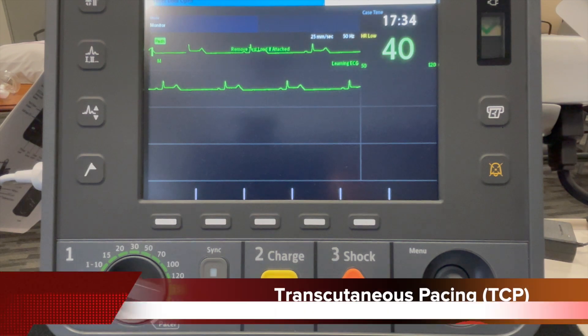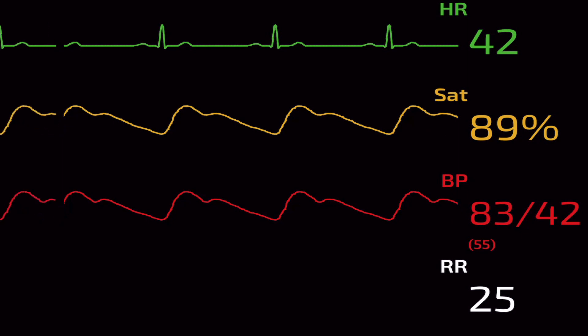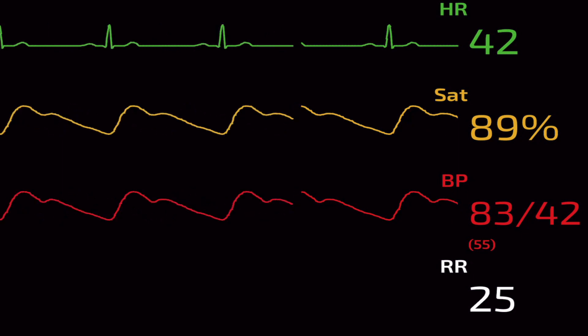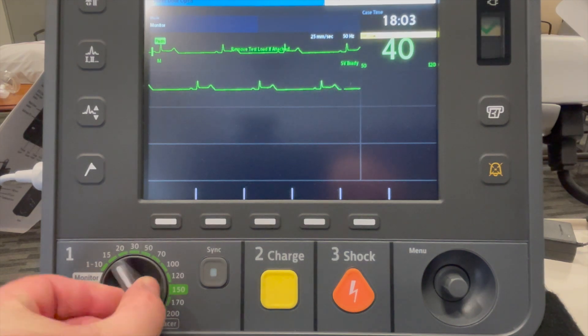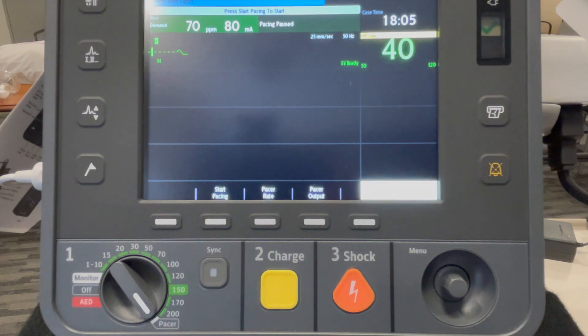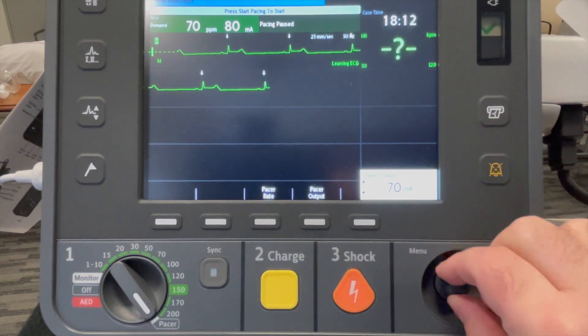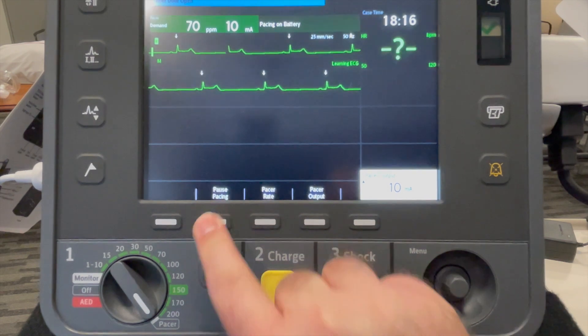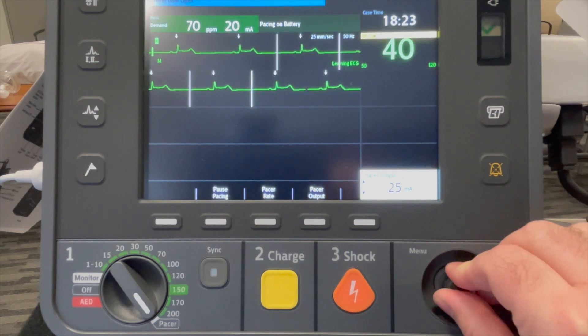Here we see a sinus bradycardia with serious signs and symptoms. The patient has shortness of breath, decreased level of consciousness, and is hypotensive. The patient did not respond to atropine and transcutaneous pacing or TCP is indicated. Ensure to attach your pads and your leads. I'll put the device immediately into pacer mode, set the rate to 70, click on output, decrease it to the lowest available, and hit start pacing. I will slowly increase my output until I achieve capture.